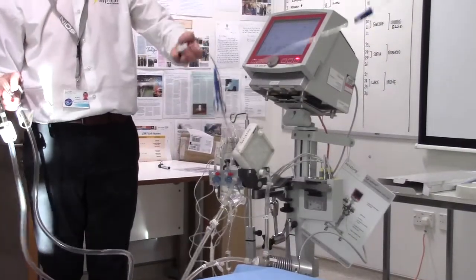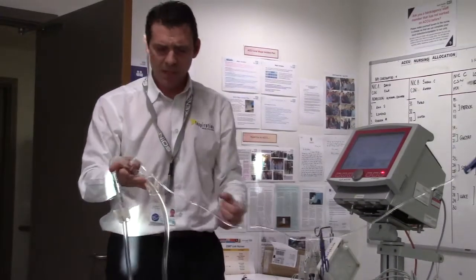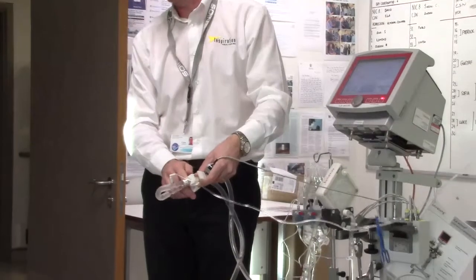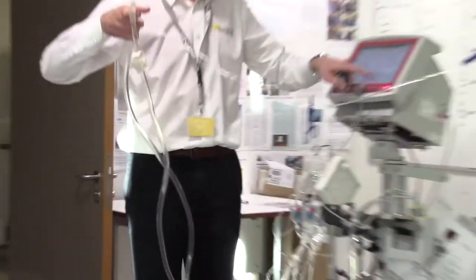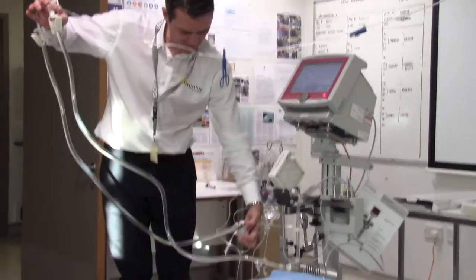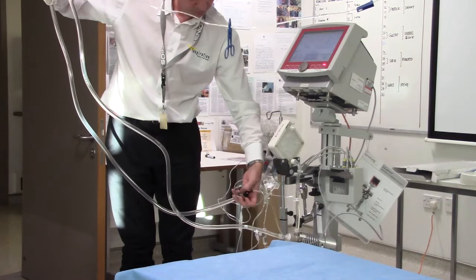There's a flow sensor to attach to the system that has an arrow pointing in the direction of flow. Looking at the system, we're taking from the patient with that arrow and giving back with the other. We're measuring the flow going back to the patient, and we've placed it just after the CVVH port.